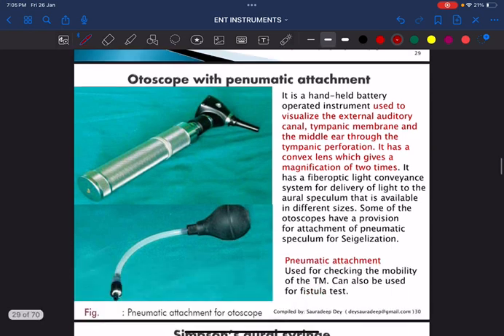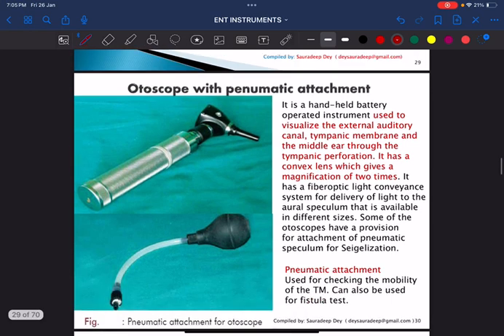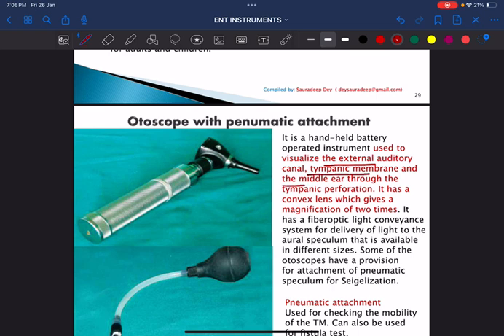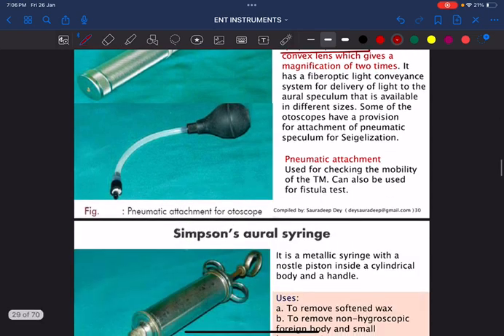This is the otoscope — a handheld, battery-operated instrument used to visualize the external auditory canal, tympanic membrane, and middle ear. The middle ear can only be visualized if there is a tympanic perforation.